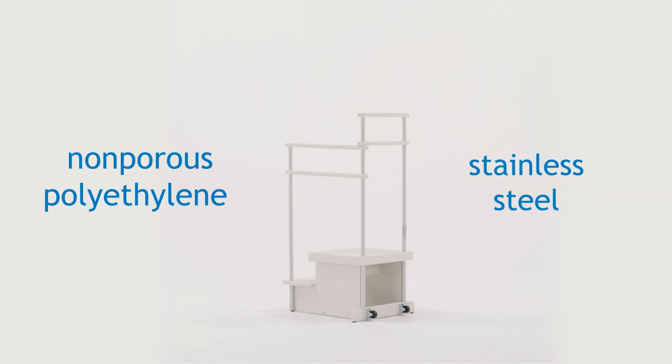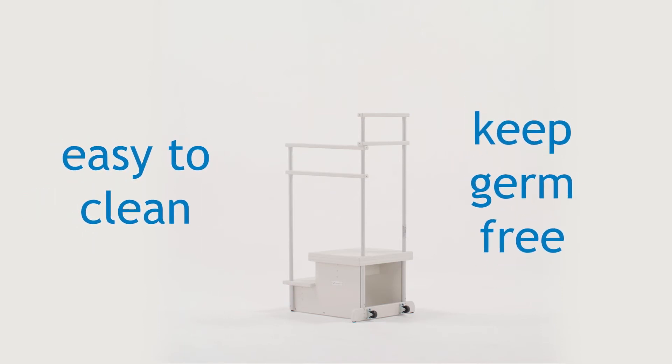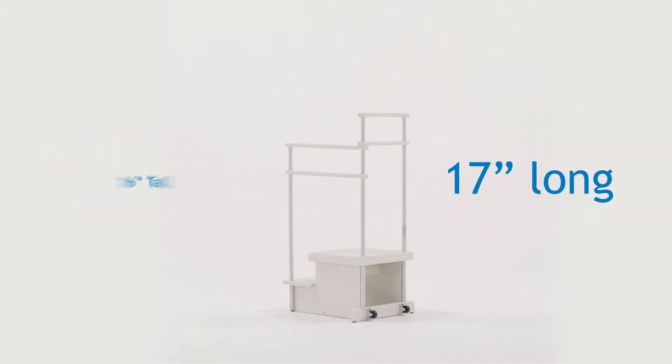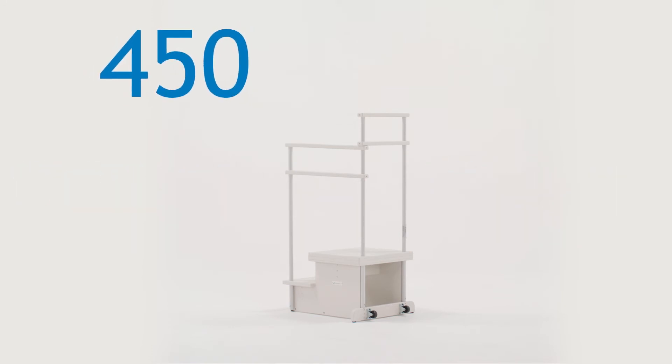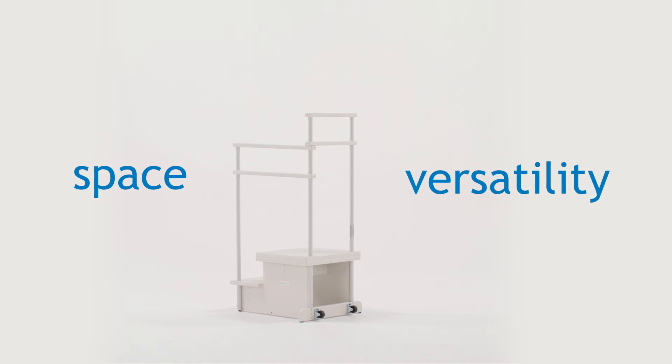Made from high-quality non-porous polyethylene and stainless steel, the standard step is easy to clean and keep germ-free. Sitting at 16 inches tall, 17 inches long, and 19 and a half inches wide, the step can support up to 450 pounds and offers plenty of space and versatility for positioning your patient.